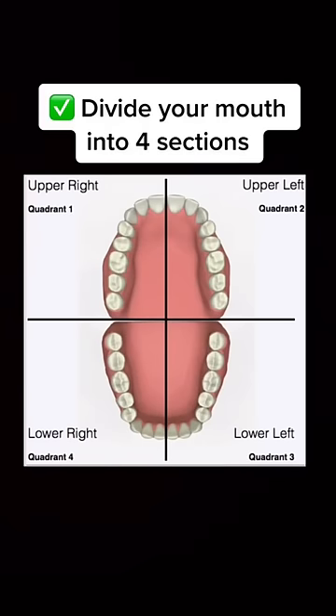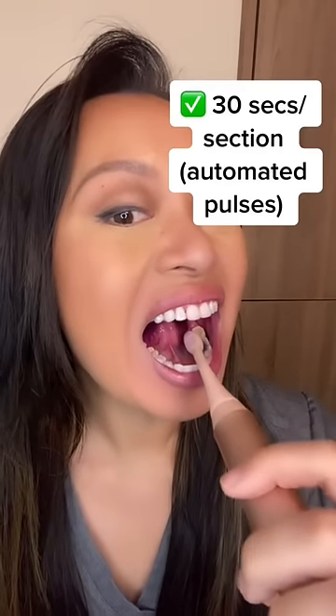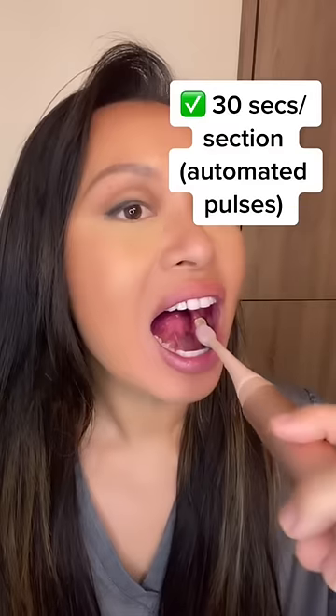Divide your mouth into four sections. You're going to brush for two minutes and spend about 30 seconds in each section.